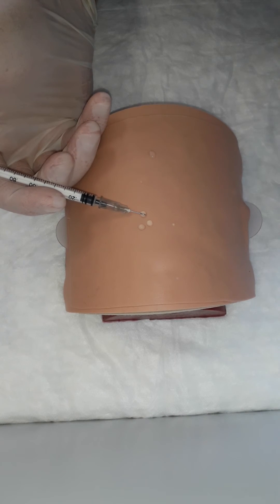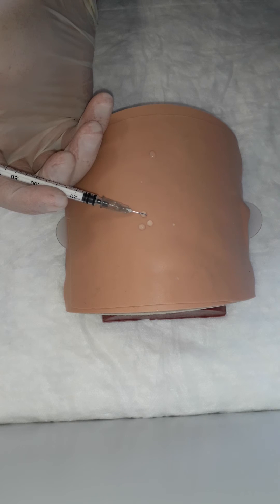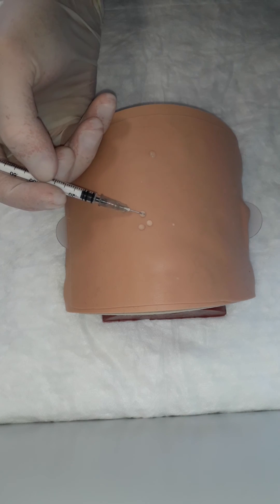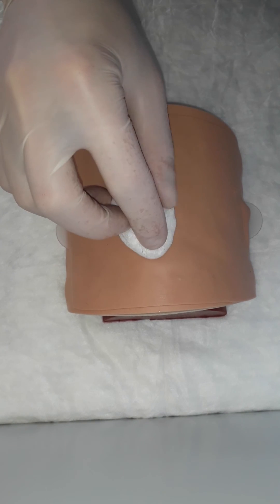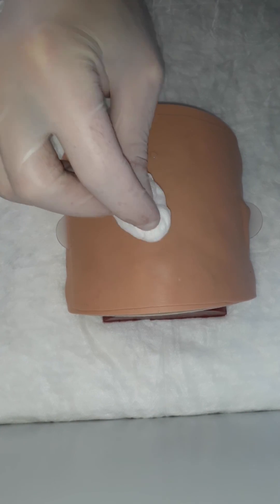If there is no bleb, it means you are too deep and already in the subcutaneous layer. After injection, take out your needle. A dry cotton ball can be placed on the injection site. And we are done. Thank you.